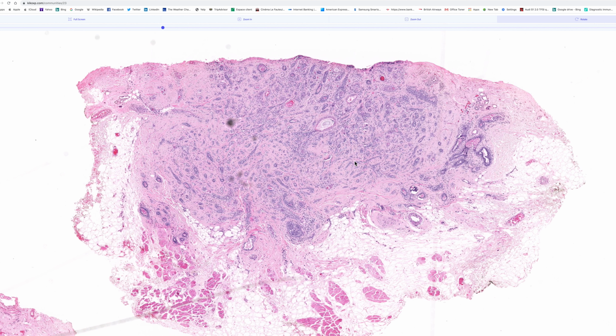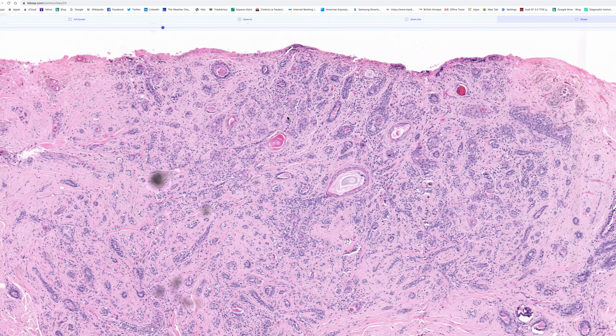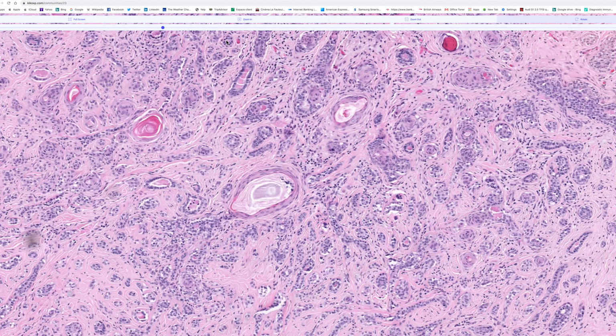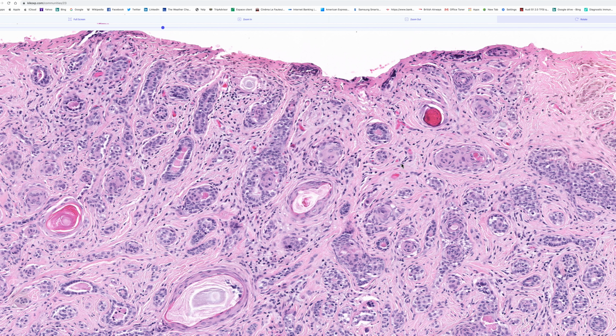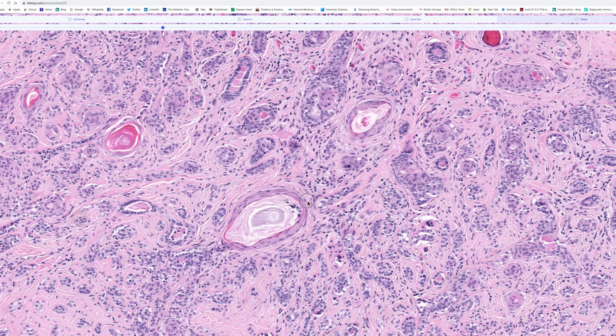What other differentials could we think about? Well, we might wonder about ductal squamoid carcinoma. The problem with that diagnosis is the squamous epithelium appears quite bland and benign. There's nothing in the histology to suggest there's a malignant squamous component. It's just bland nests of squamous epithelium.